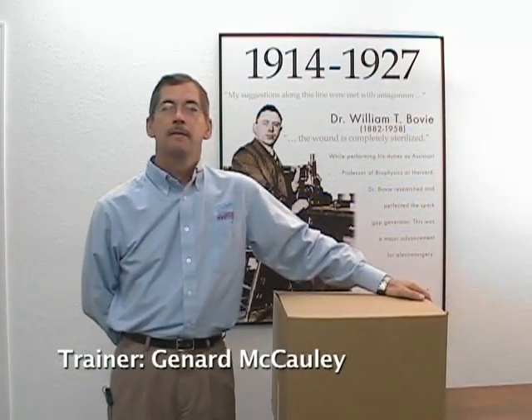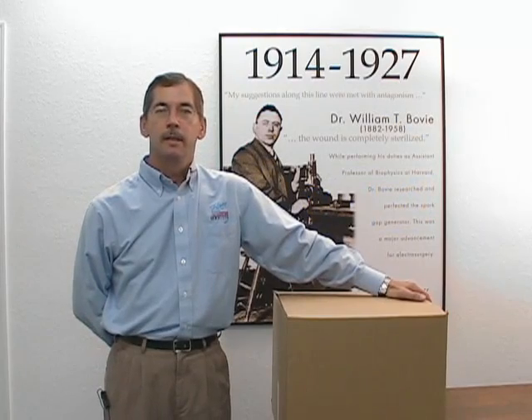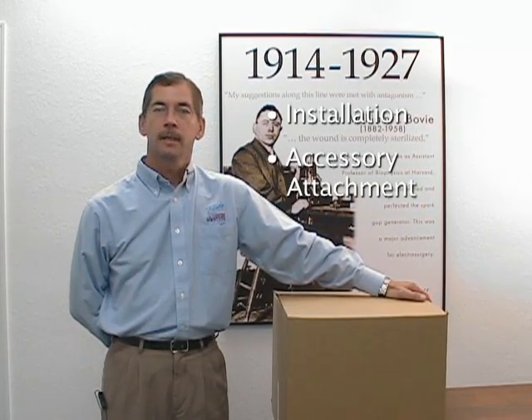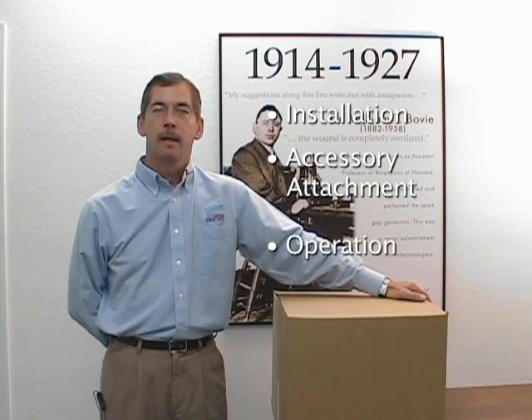Hello and welcome to the ARIN 1250 installation and setup video. We will be discussing the installation, accessory attachment, and operation of the ARIN 1250.